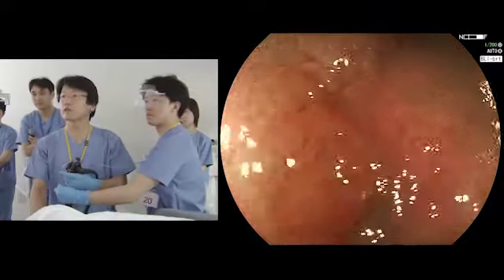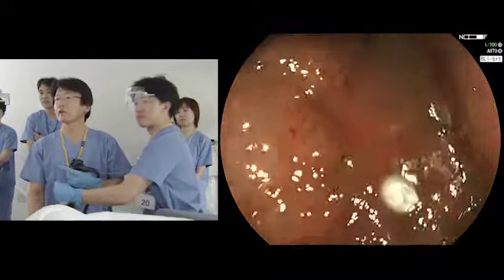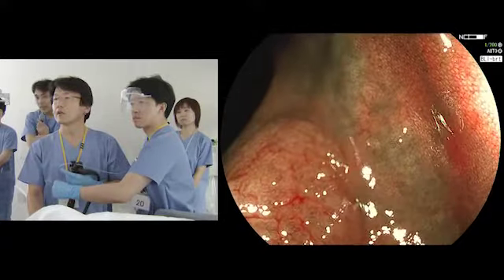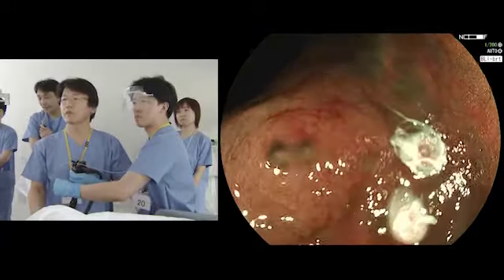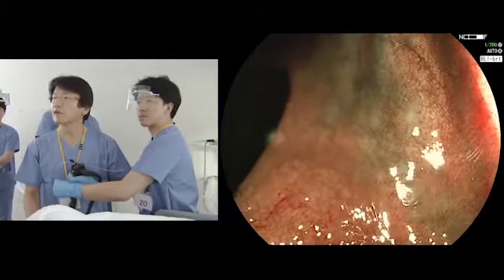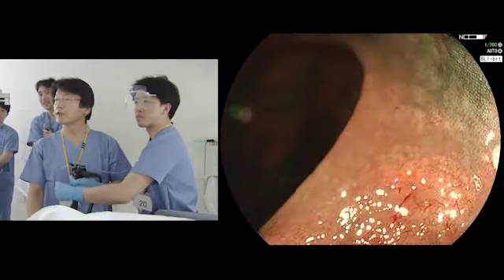Okay, needle out. So see the demarcation line and needle out. Is it out? Okay. Like this. Okay, again. In case of making marking, to use soft coagulation is a very important point. A little strong, even if Professor Yamamoto used soft coagulation, so it's better to reduce your power. Yes. Yeah, this is better. So this is the demarcation.